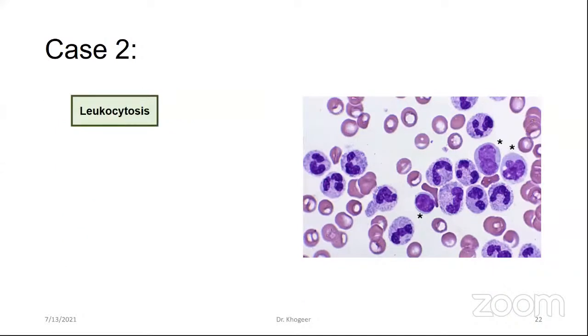So the leukocytosis is characterized by increased neutrophils, which we call neutrophilia, which is an increase in the neutrophil count above the reference range. The 3 main causes of neutrophilia are infection, inflammation, and malignancy. It can also be either pathologic or non-pathologic. On the other hand, it can be a result of primary causes like MPN or secondary causes like infection and others.